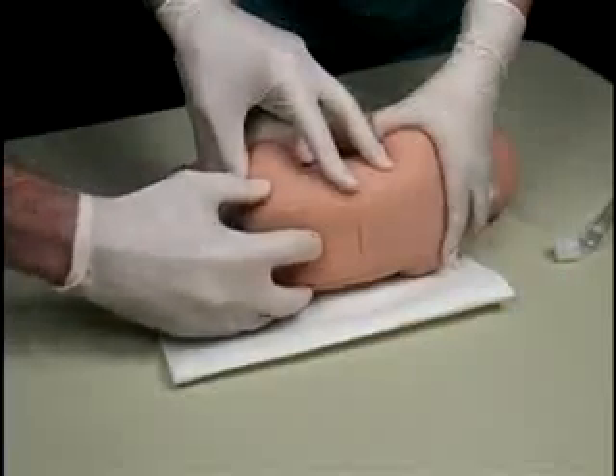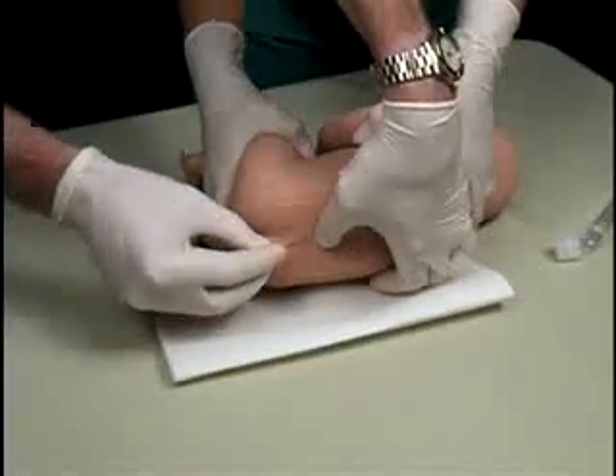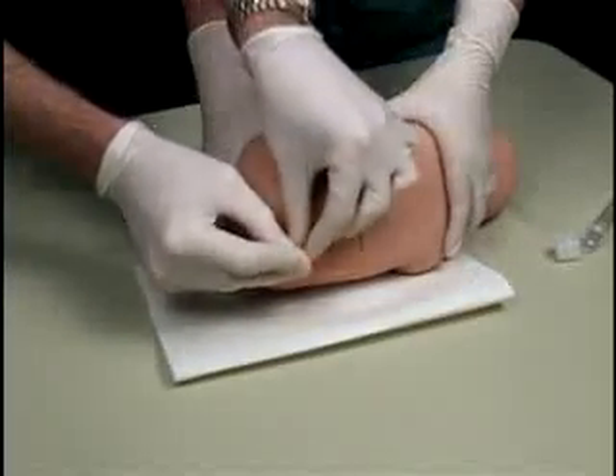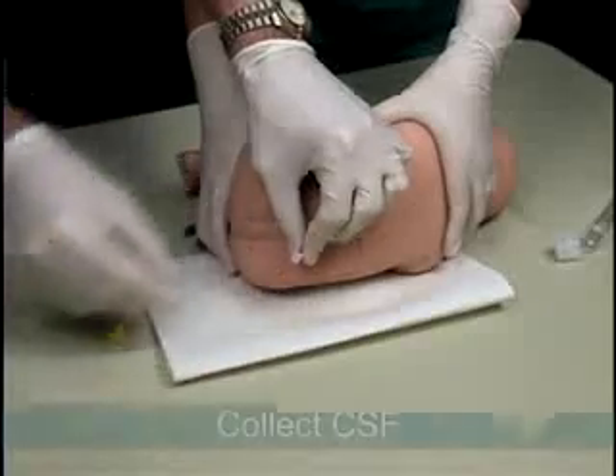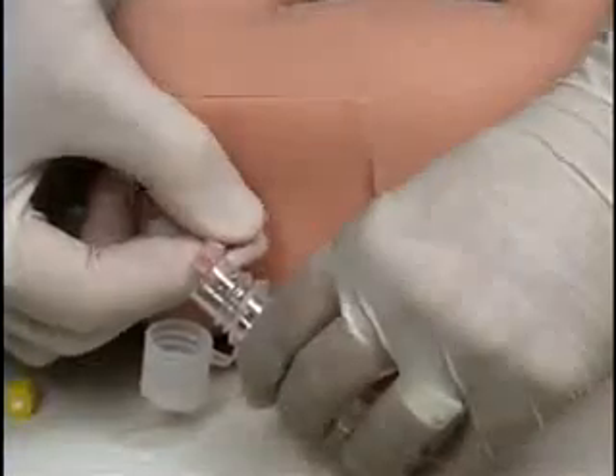When using the blind technique, the trainer's landmarks can be palpated, including the spinous process. During the procedure, the user will feel a slight change in resistance when entering the subarachnoid space, and cerebrospinal fluid will be present when the stylet is removed.